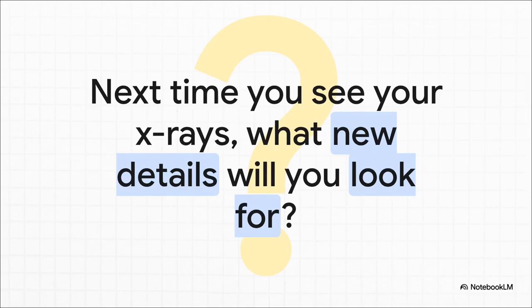So, the next time you're at the dentist and they put your X-rays up on the screen, you won't just be looking at some confusing black and white picture. You'll be looking at a map of your own health. And the question is, now that you know a little bit more of the language, what new details are you going to look for?